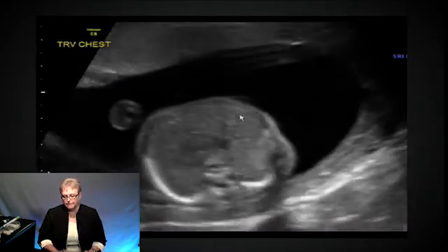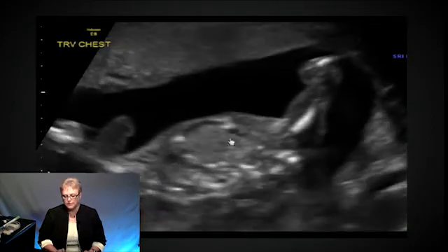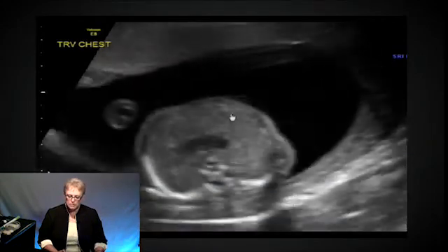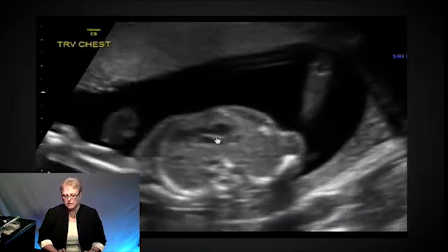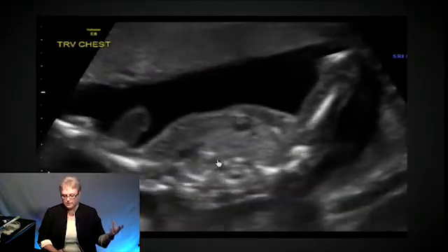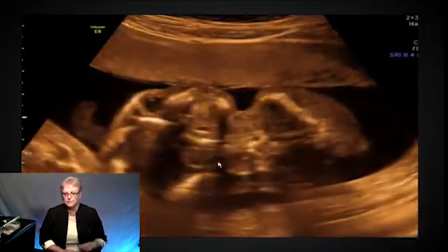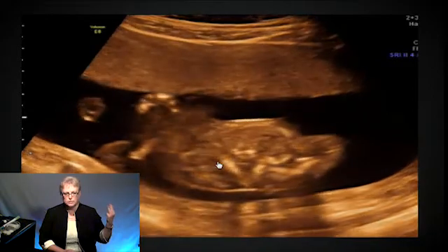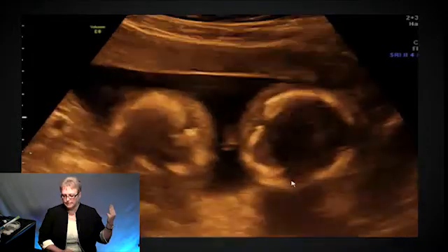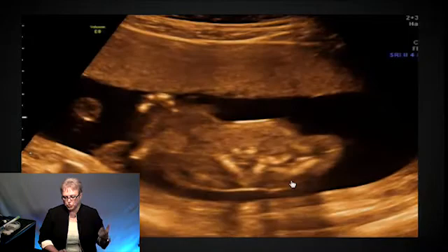Look at that heart. This is posterior, anterior, left, right. Well, what can we say about the heart? Looks kind of bulky there, and it's kind of midline, huh? What do we say about cardiac axis? That's your first sign that something's going on, right? Looking at the heads. Did we say 1 torso, 2 arms, 2 legs, 2 heads? So these are conjoined twins.